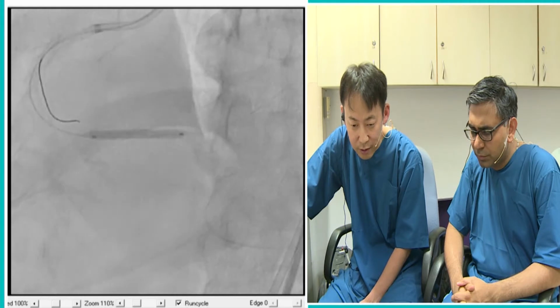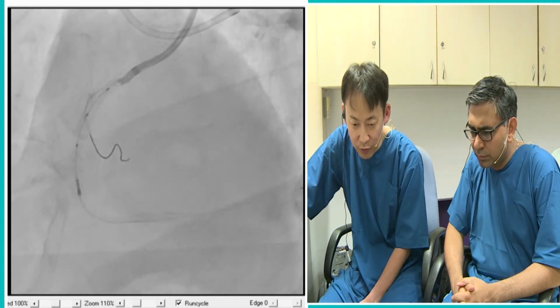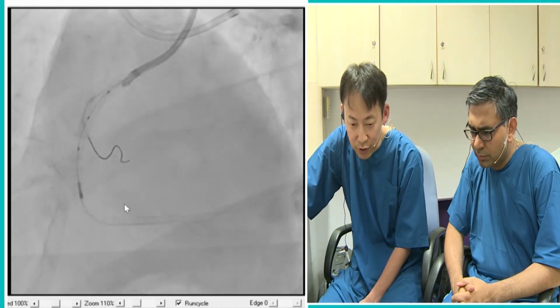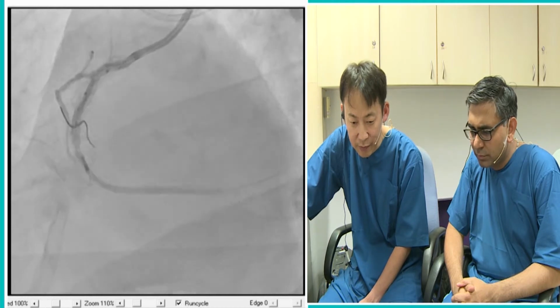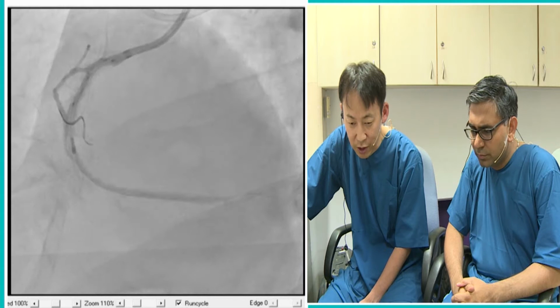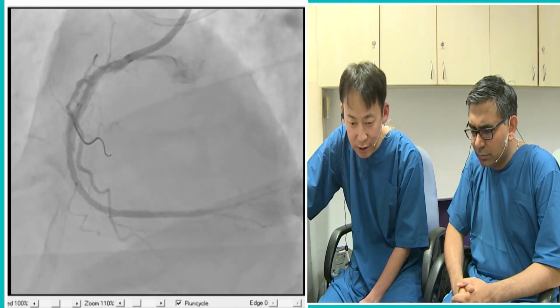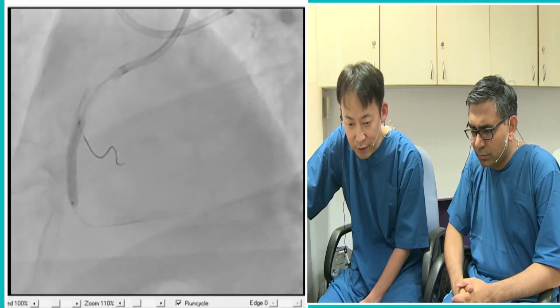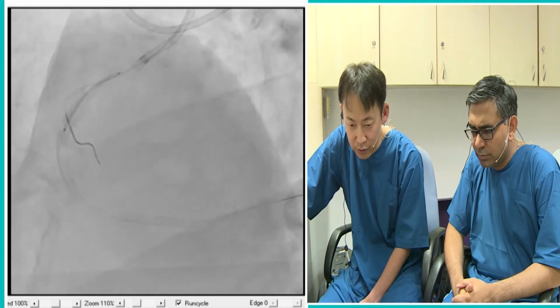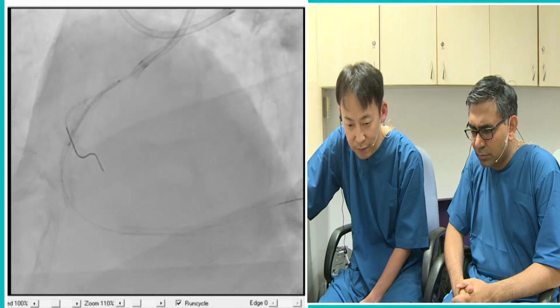And then on the proximal side, I put the 3.0 and the 3.5 stents from here, because between them this portion is quite normal on IVUS findings, so we don't need to put in stents. We don't need the full metal jacket for this case. So I put the 3.0 by 28 Ultimaster, and on the proximal side I use a 3.5 Ultimaster 24 again.